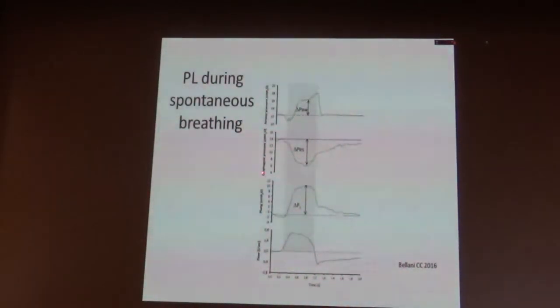It can be done very simply by adding the pressure on the ventilator plus the negative swing in esophageal pressure, and it gives you an idea of what total transpulmonary pressure the patient and the ventilator are developing. And for some patients, we say, well, if it's higher, if the total is close to 30 centimeters of water, it's better for the protection of the patient to go back to sedation and even paralysis if needed in some cases.